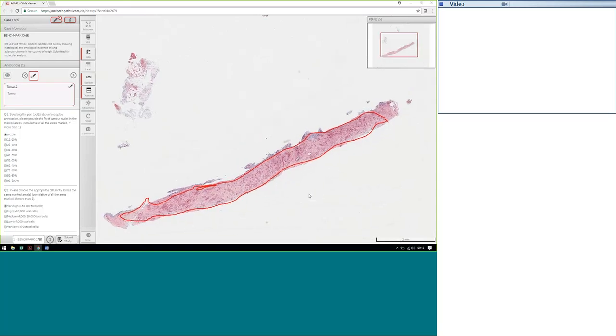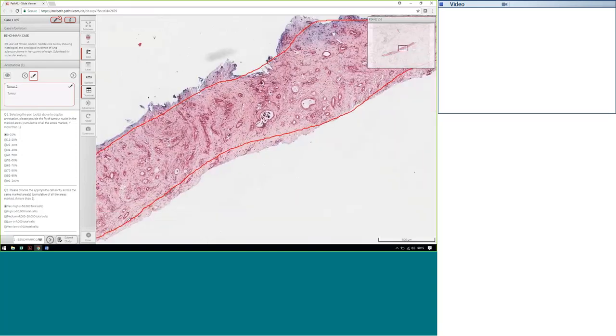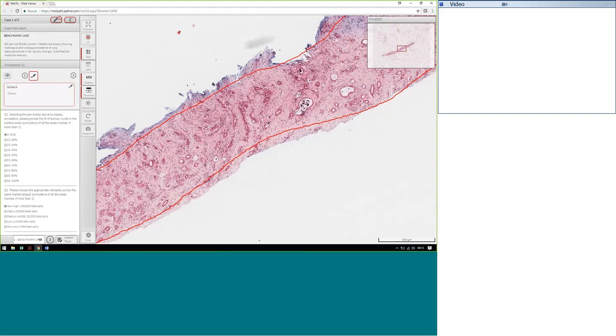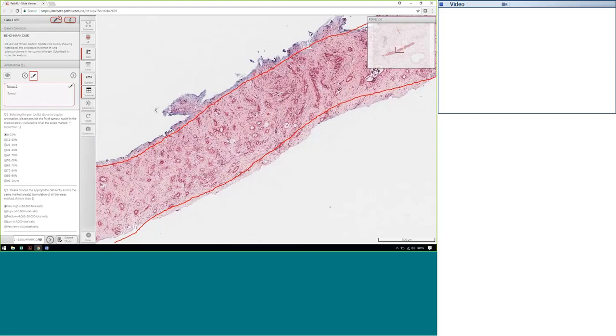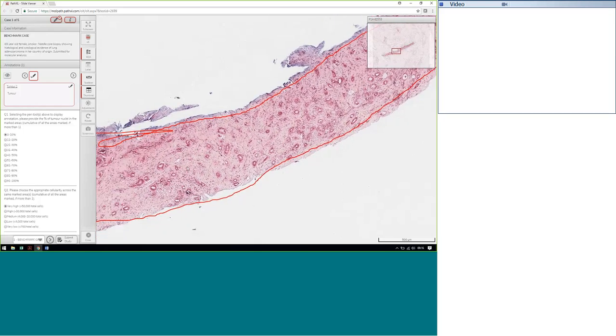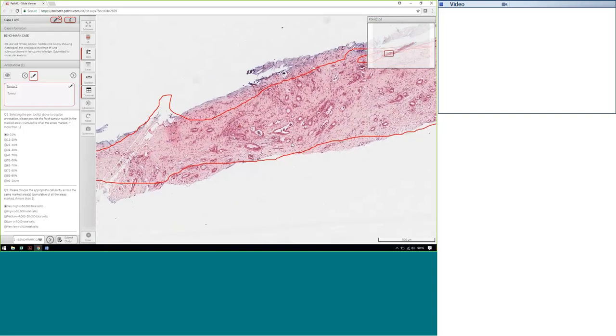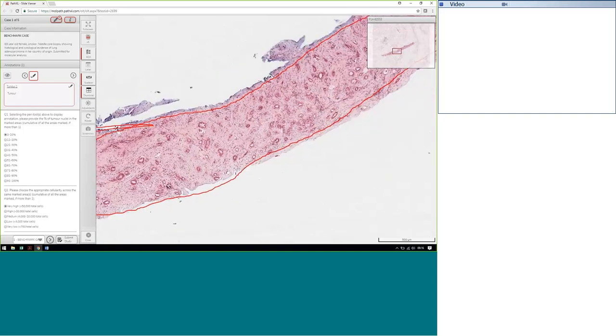You can see there the annotation was predominantly the whole tissue, and within that the experts scored 11 to 20% tumour content. If we go to a higher magnification and move around, we can see the scattered tumour islands with a background stroma and occasional inflammatory cells. However, the tumour is well dispersed, and that is why I think the experts agreed that it was 11 to 20%.